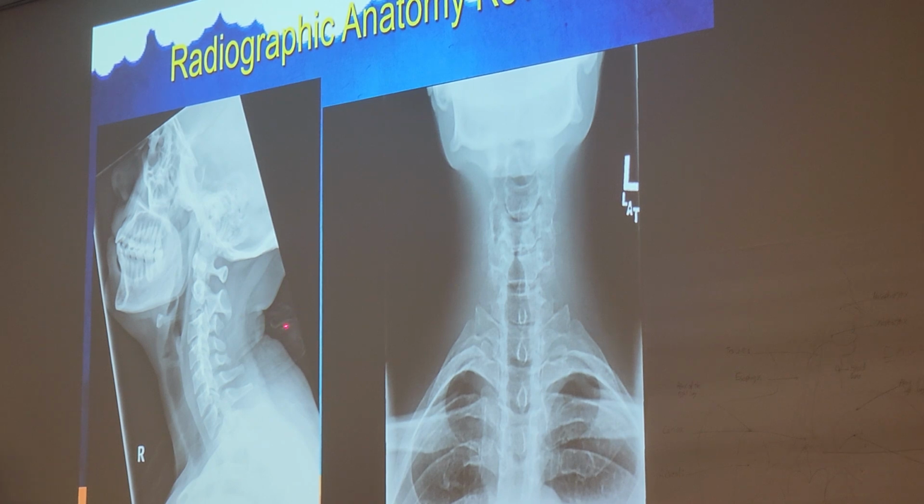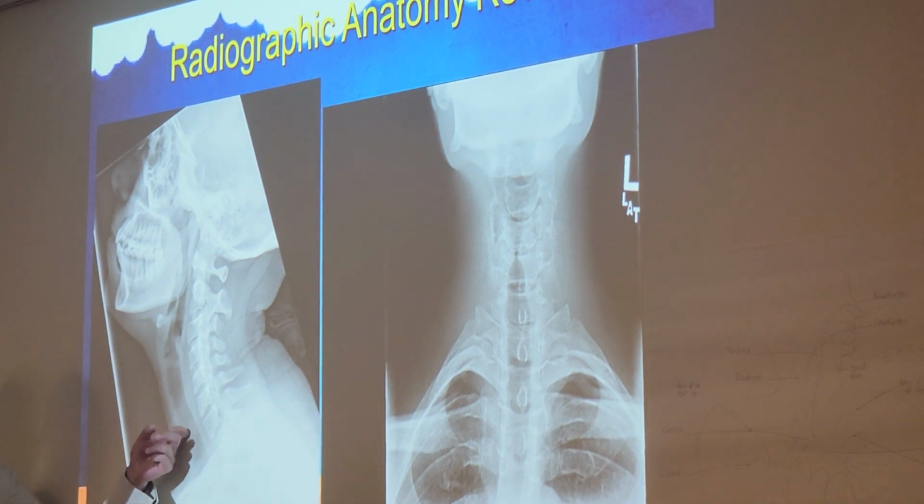Not a C collar, it just looks like a collar from a shirt. Now, why is that a bad thing? Because depending on the thickness of that artifact, that might be obscuring something that the radiologist needs to see in the actual trachea right there. By the way, once again, this is the air-filled trachea, not the esophagus. Please do not label that as an esophagus.